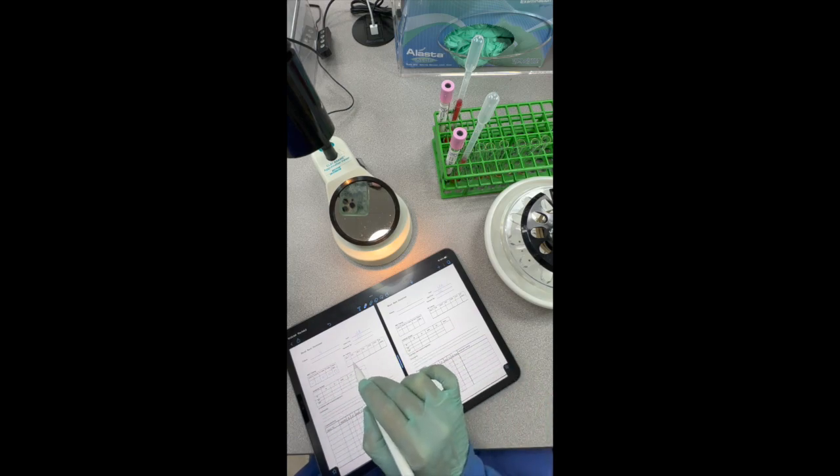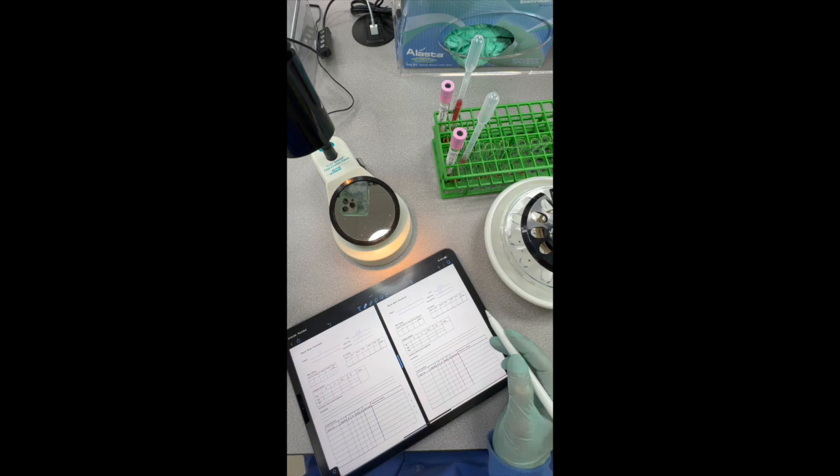Very good. And now we're actually going to carry our Ds through AHG phase, so we can determine. We're going to do that weak D test. Okay. So let's read our other patient here.